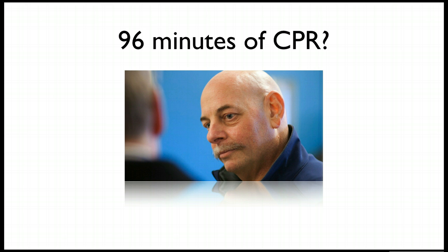This guy is Howard Snitzer. He had a cardiac arrest several years ago, and even though he never had ROSC after multiple meds and shocks, his end-tidal CO2 still remained high, and so the team felt like they needed to continue and actually resuscitated him for 96 minutes straight before he finally got ROSC. And so this is a very good case of how capnography worked well. He's still neurologically intact and able to walk and talk today.